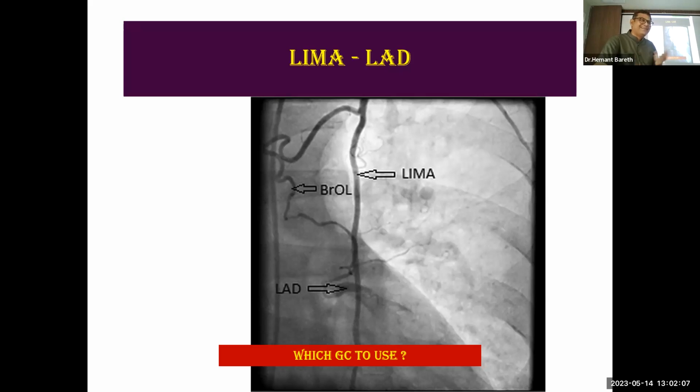Lima. Lima catheter or IMC catheter. Or if nothing works, then the final thing is AL. Nothing works, then AL.